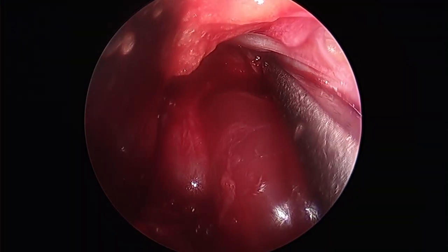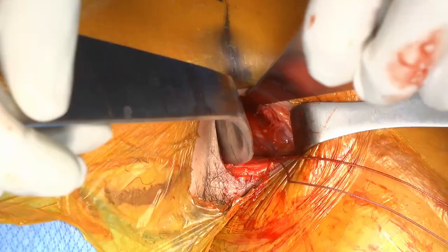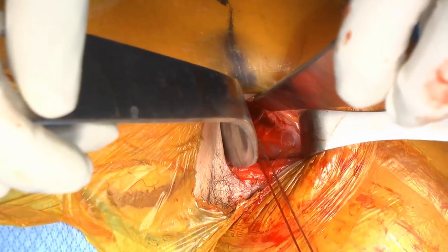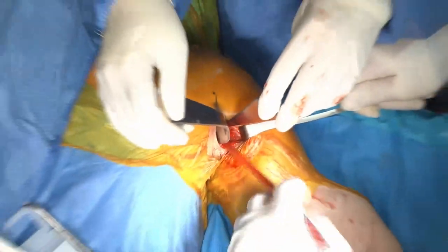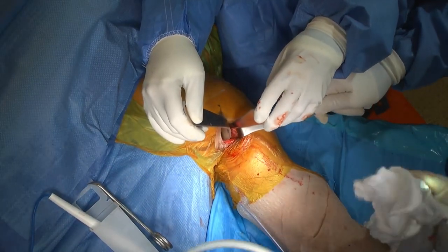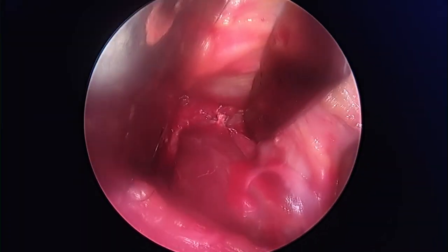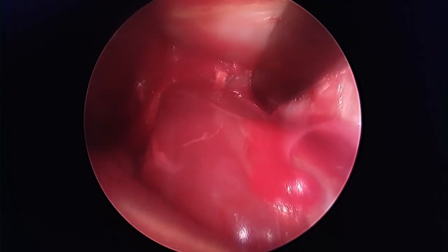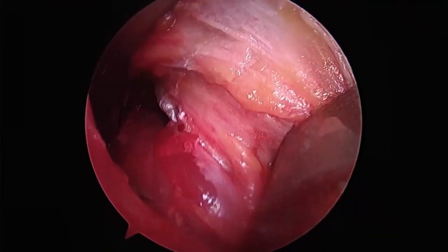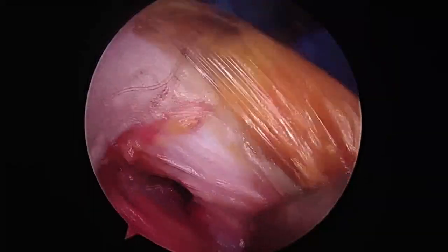So we're going to cut our sutures, and we'll be all set. Okay, we'll hold that there. We just need the open-ended cutter, same thing we had before. Got this. That's our final closing view. I don't think there's much else to see there that we haven't already seen. That looks pretty good. And we're all set. And we'll just take this and drop that over the top. Take that out. And then we'll take this out here. And that's our biceps. And we're on our way out.